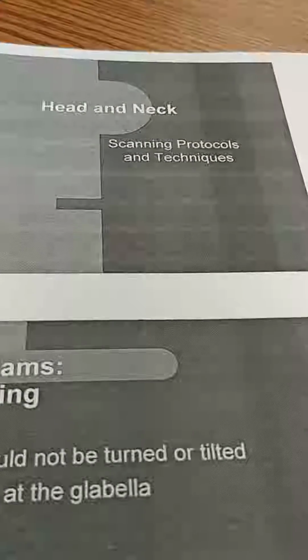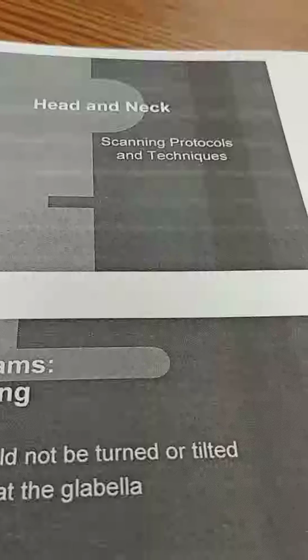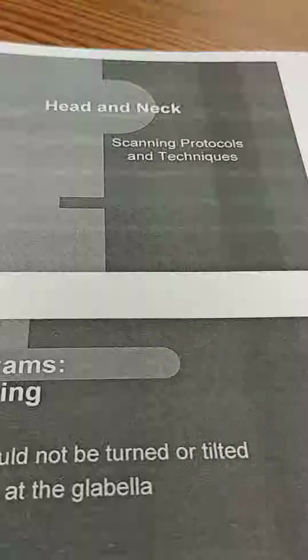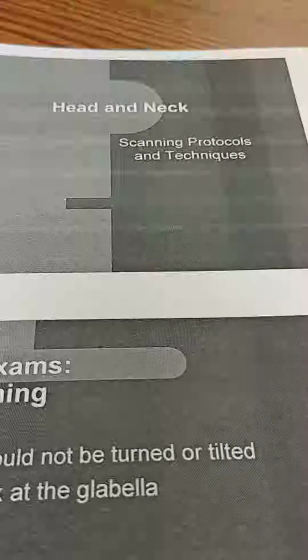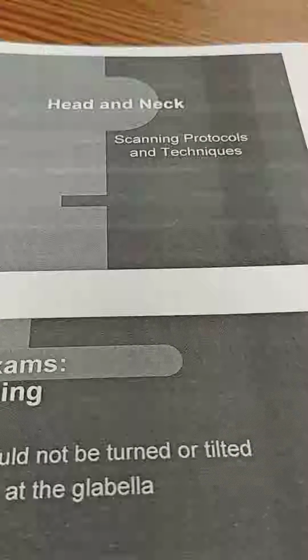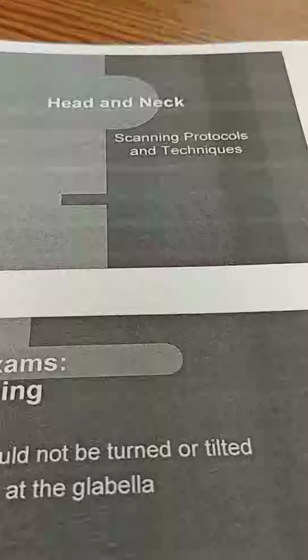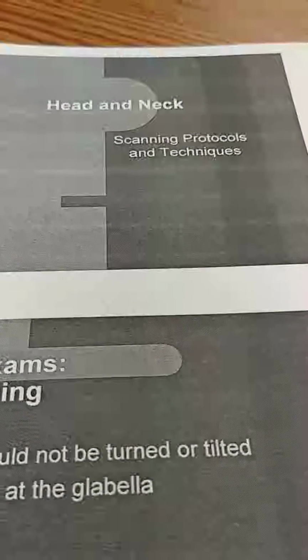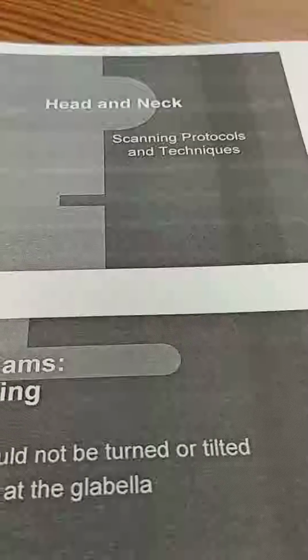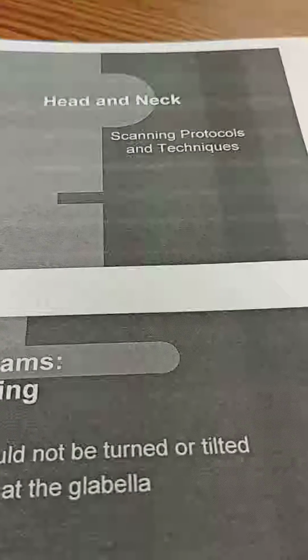Okay, because somebody else here said they didn't know where it was, asked the tech, and the tech didn't know where it was. So on the GE, it's clearly displayed. You have your TR, you have your TE, you have your flip angle, and then you have your TI. So it's clearly there.